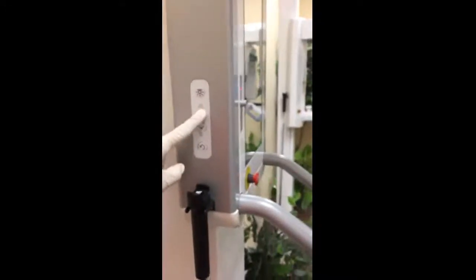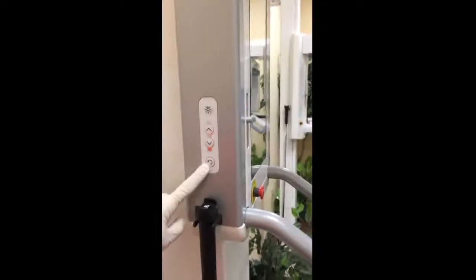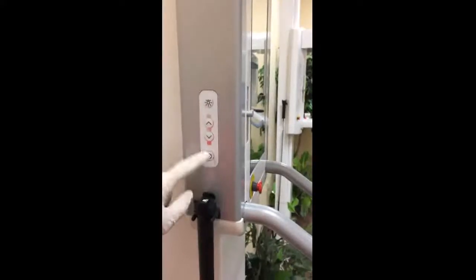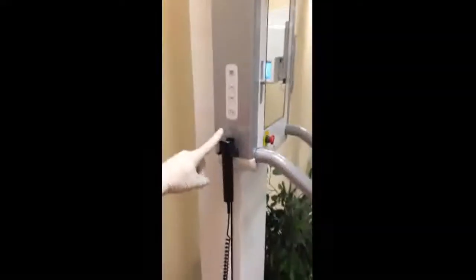Next, you have an up and down arrow. They do exactly what you would expect. They move the machine up and down. And lastly, you have a reset button. It looks like an arrow going in 3/4 of a circle. This puts the patient in position. Hanging on the side of the unit is your exposure button. You may also have a wall switch.